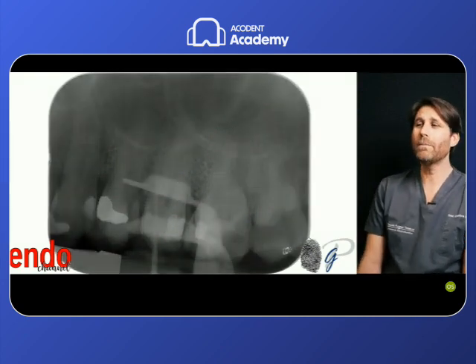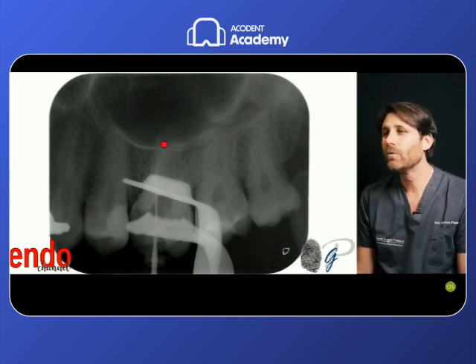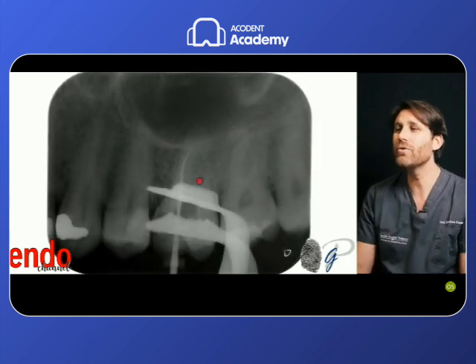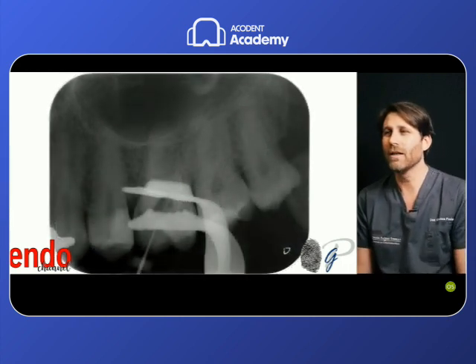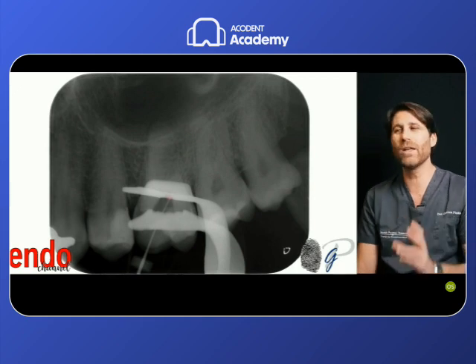This was an upper molar, mesial root canal, manual scouting. We missed just 1 or 2 millimeters of the apical third, and then we pushed with the Reciproc file to reach the working length. But more interesting, the distal root canal, more evident, we missed all this part of the root canal, a couple of millimeters of the root canal. With the hand file, we were not able to reach there.